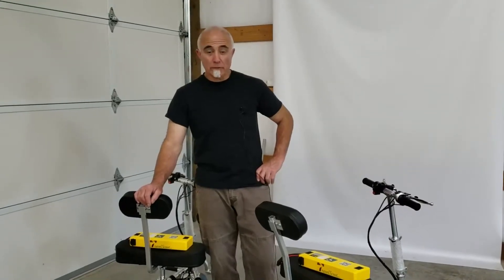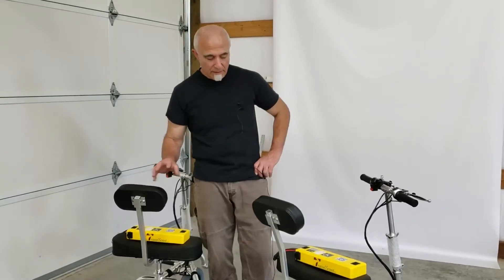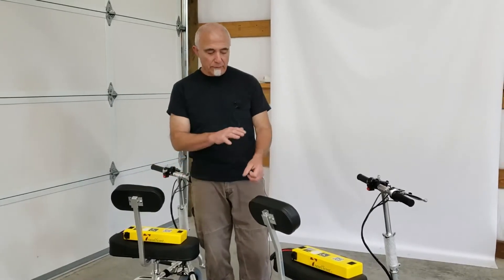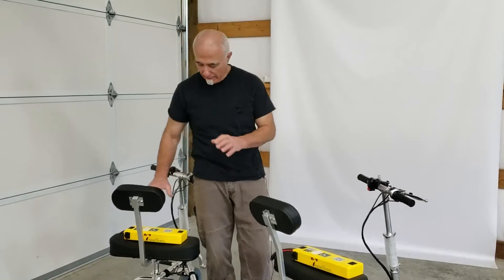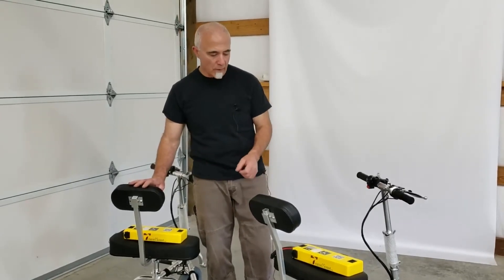Hi folks, this is Tony at TravelScoot once again, and in this clip we're just going to show you very briefly how the batteries are installed on the TravelScoot full-size and the Junior. This applies to the TravelScoot Deluxe as well as the Shopper.